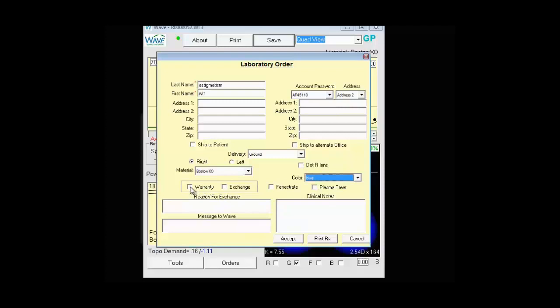This is also where you specify if you want to warranty the lens or if it's an exchange. If it is an exchange, you'll need to enter a reason that it is an exchange. And on the bottom, we have Message to WAVE. If you want to send a specific message to the WAVE office with this lens order, enter it here.